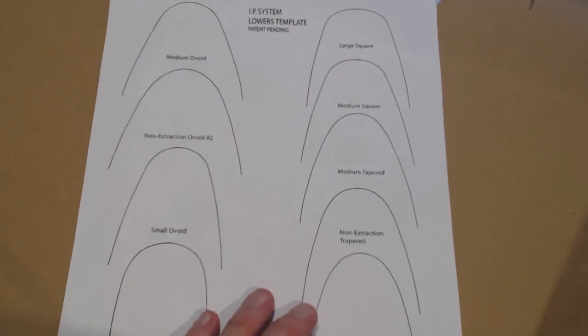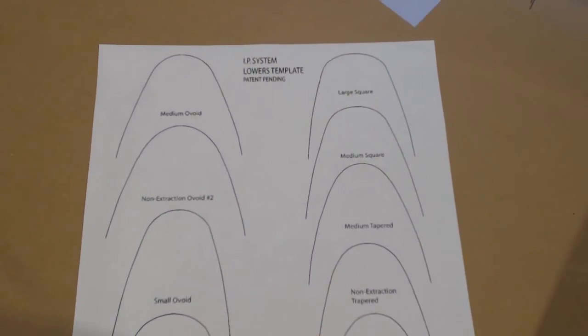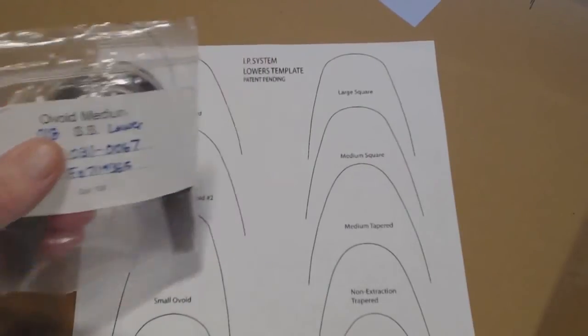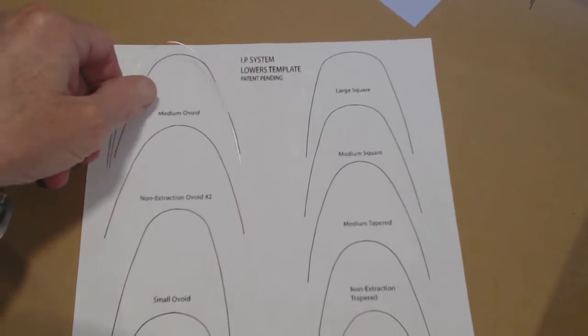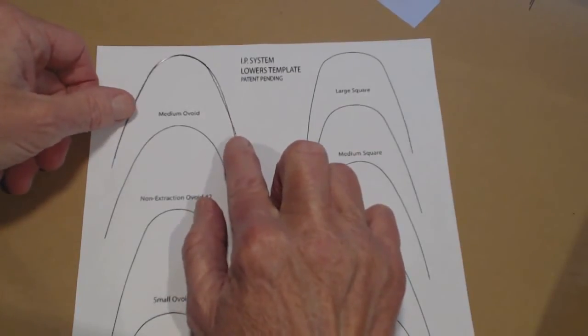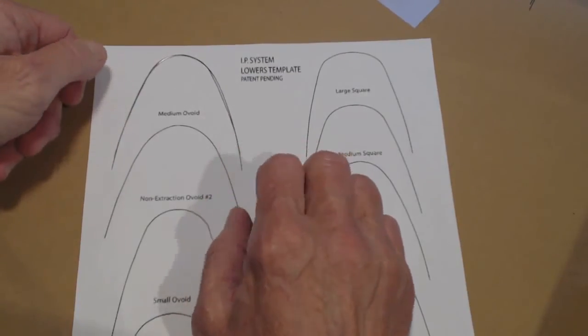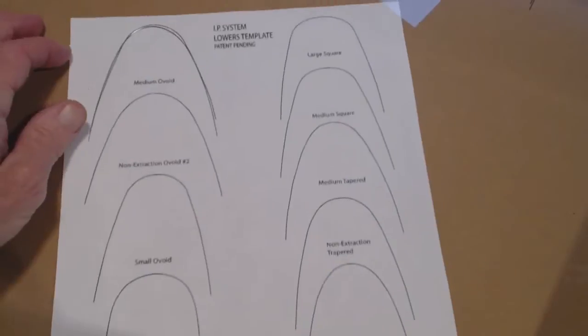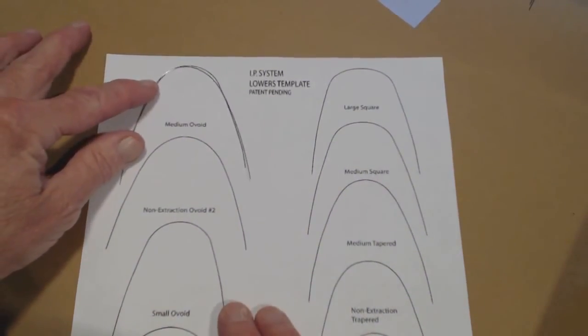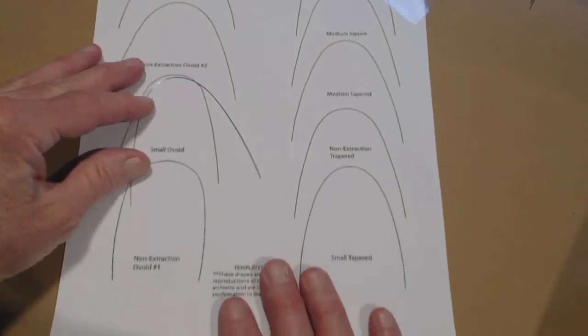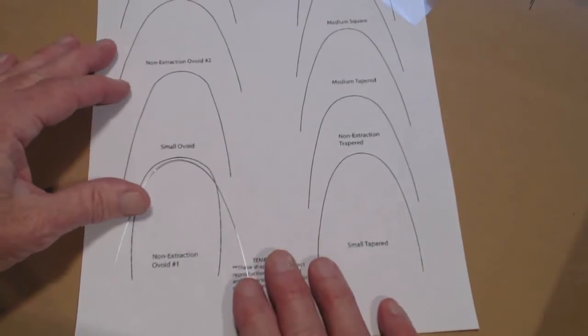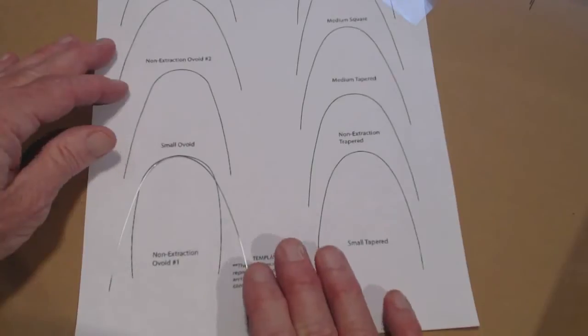What we're going to start with today for the exercise is a medium ovoid that's stainless steel lower. I'll take one out of the bag, and we're going to put it on top of the template to check this. Its shape is pretty close. There's a disclaimer on the bottom of the template that says these are not perfect, but it's pretty close for this endeavor. Now, I want to change this into a non-extraction ovoid 1. So I have to change those radii. The radius in the front for a medium ovoid is too small.